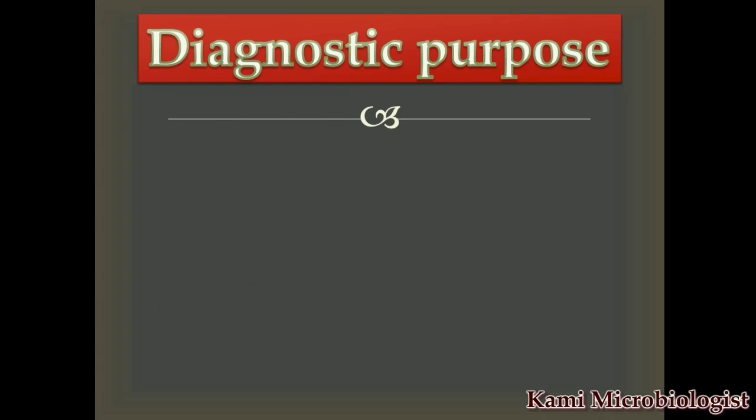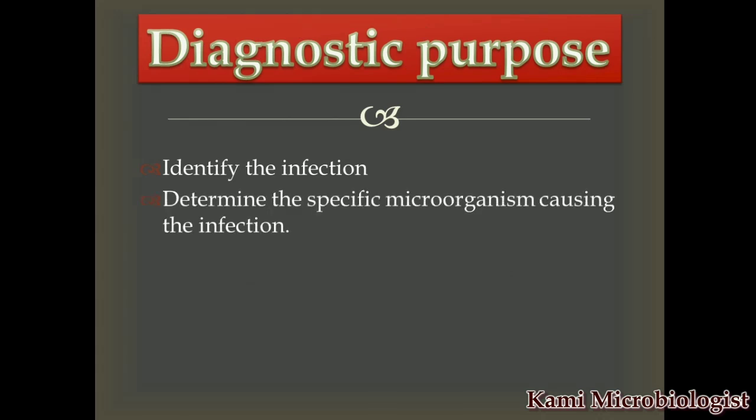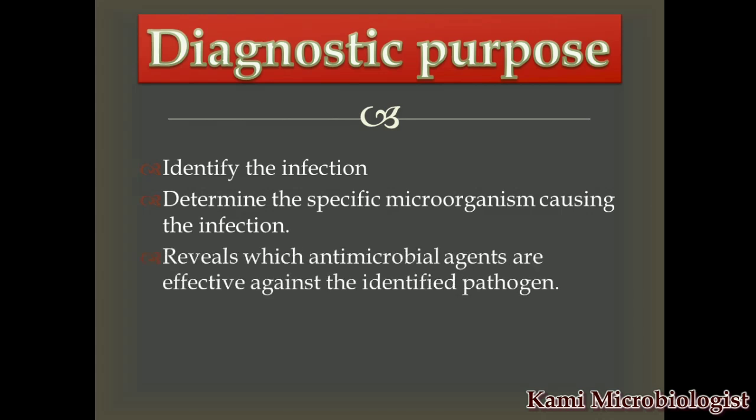Then what is the diagnostic purpose, meaning why we perform this test and why the doctor recommends it. This test is specially performed to identify the infection. Moreover, this test is used to isolate the specific microorganisms that can cause infection in prostatic fluid. It is also important to check which antimicrobial agents are the most effective against the identified pathogens, and to check the response to the treatment which we are providing. These are the diagnostic purposes for why we perform this test.